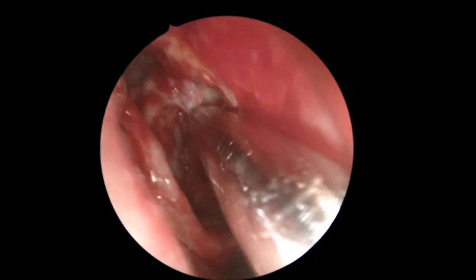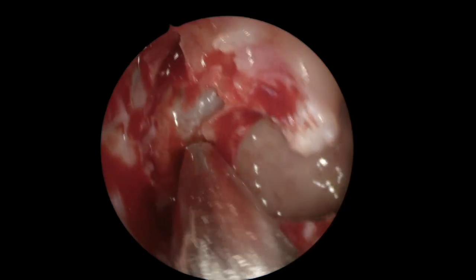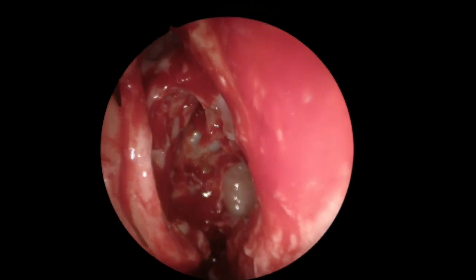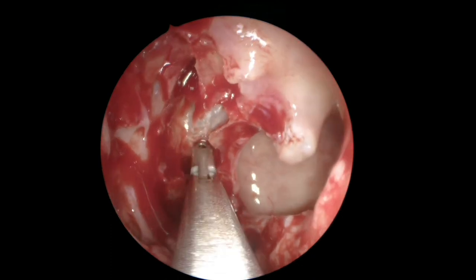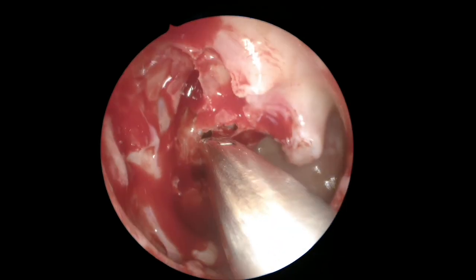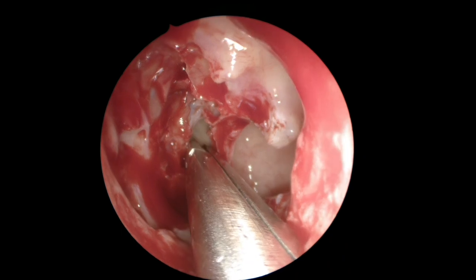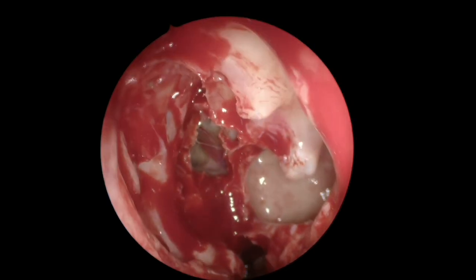We're removing all the bone and mucosa just to know exactly where we are, and we're preparing to enter the posterior ethmoid. The safest place to enter is inferiorly, just below the basal lamella. This is the first posterior ethmoid cell — you can see it's a bigger cell than the anterior ones. It's very easy to confuse this cell with the sphenoid because you are very far posterior at this point.